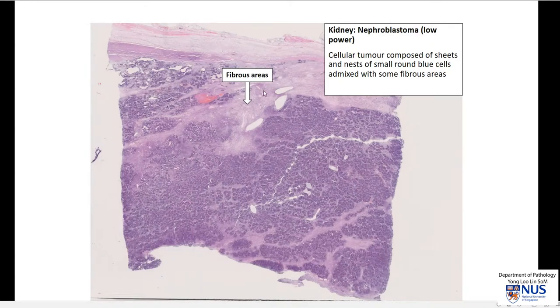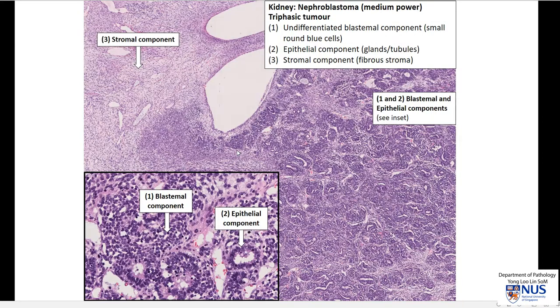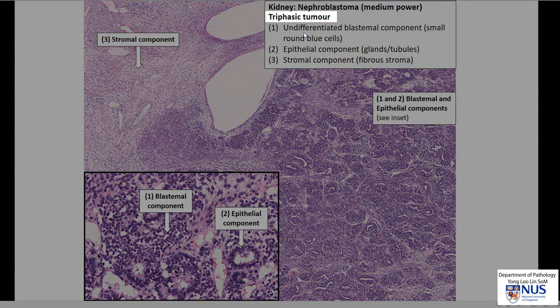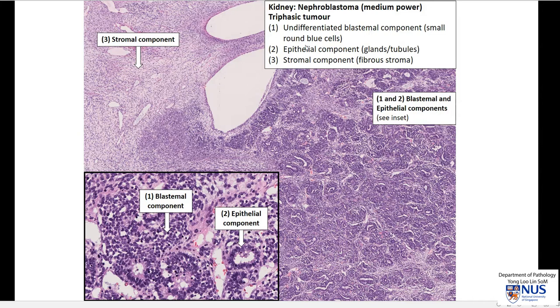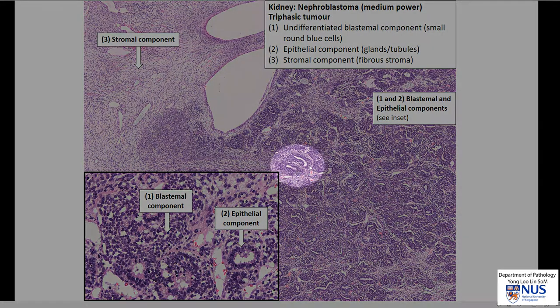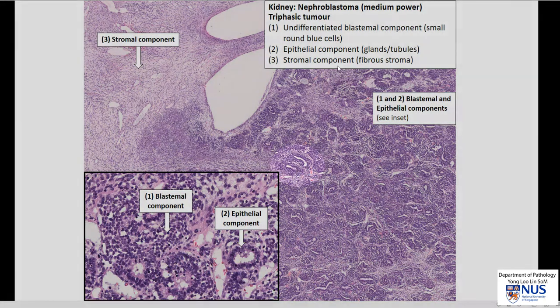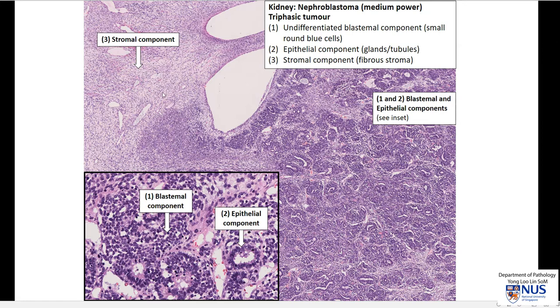There are also some pinker areas which may point to other tissue types. Looking at this at higher magnification, this is a triphasic tumor. The first component is the blastemal component, which is literally the small round blue cells — there is no real architecture, just sheets of small round blue cells. The second component is the epithelial component, which may form glands or tubules, as seen here. It also has a stromal component where the cells are a lot more elongated or spindly. So this is an example of a triphasic nephroblastoma.